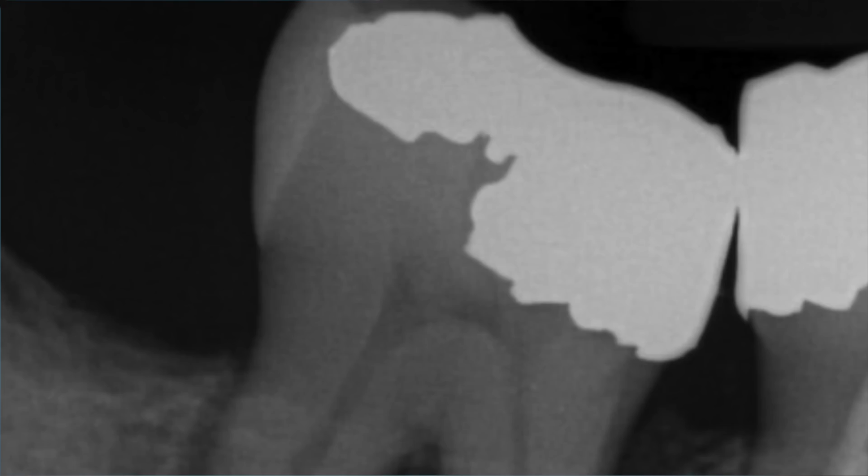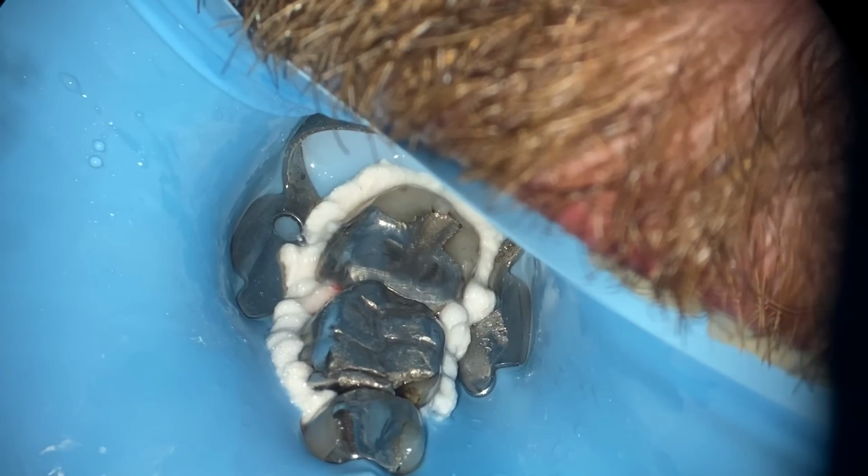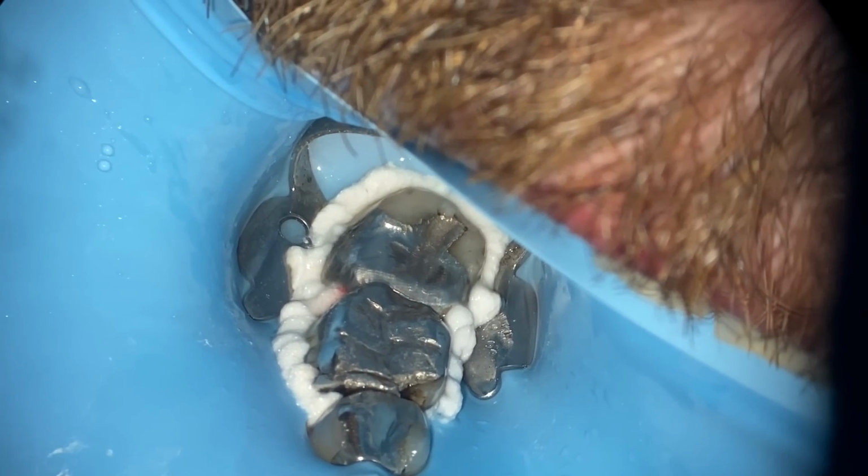First thing is, before you get into those, we all take periapical radiographs, but also take a bite wing to see how much that orifice has regressed, or how much calcification has been laid over top of that orifice. So a bite wing radiograph is really helpful for that.